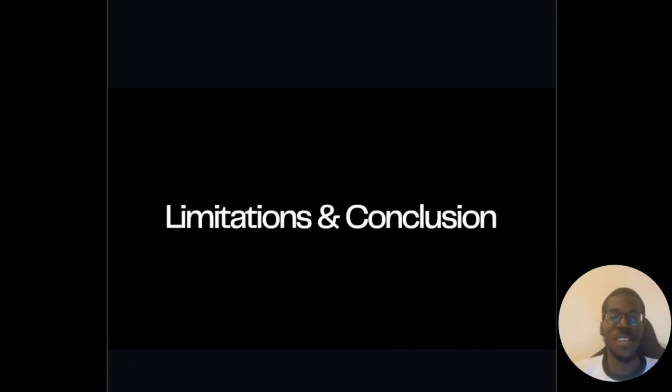So yeah, let's just look really quickly at some limitations and then we can wrap up with our conclusion. I would say the biggest limitation of this entire project is probably one, the reliance on MFT, and two, it's only based off the STIR dataset. So we only tested the models as well as KIOFA on the STIR surgical dataset. We know that a real operating room would have a lot more unpredictable things happening. The STIR dataset was a controlled type of dataset, so it might not reflect to the fullest extent what an actual operating room would be like.